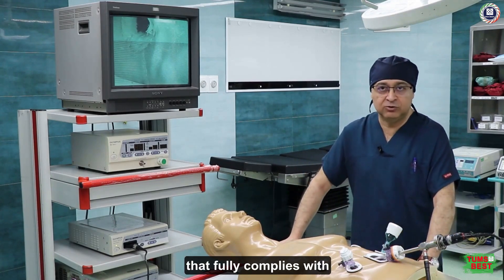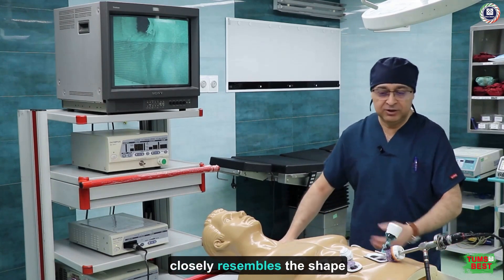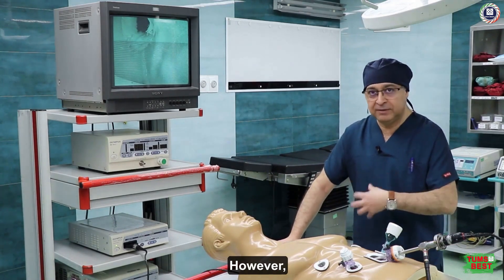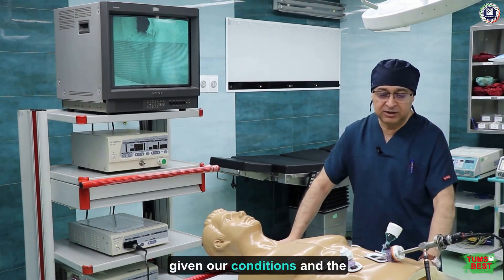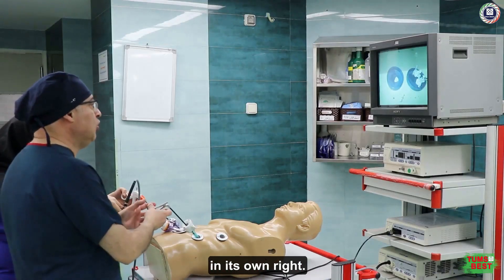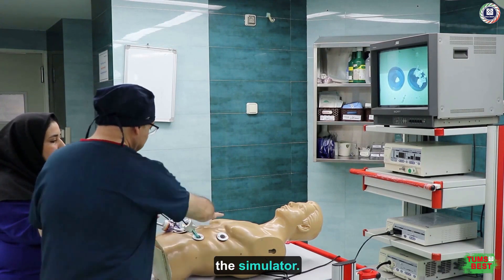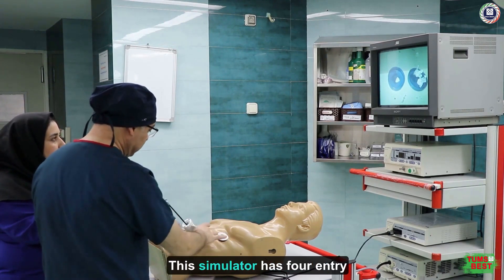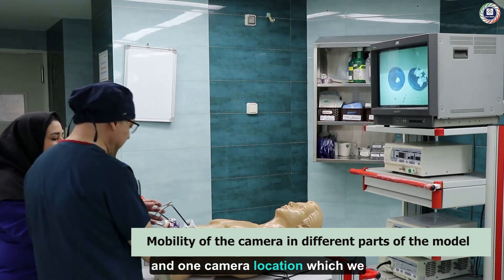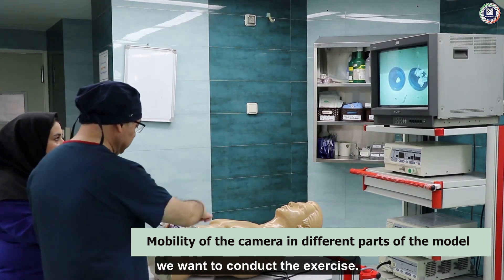Various books have been studied and we have created it in a way that fully complies with global standards. One of its advantages is that it closely resembles the shape of a human body — although it cannot be said to be identical, given our conditions and the practical precision we require, it is considered quite capable. Now we are demonstrating a training exercise. This simulator has four entry points for ports or trocars and one camera location, which we can move to any of these points depending on where we want to conduct the exercise.